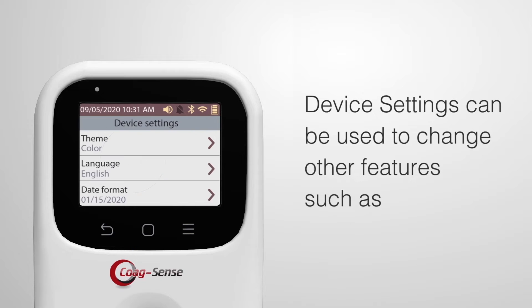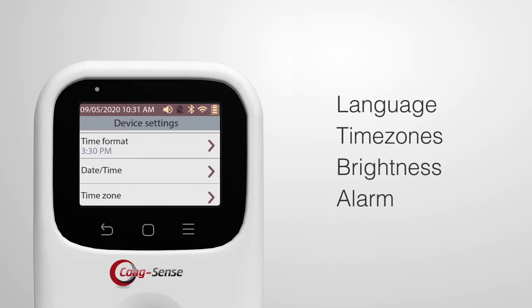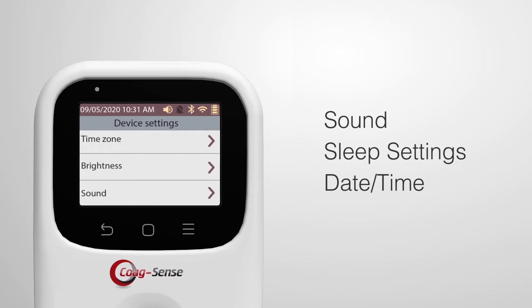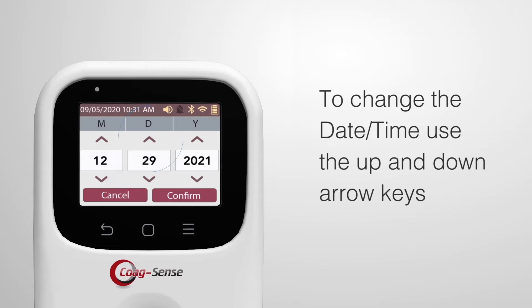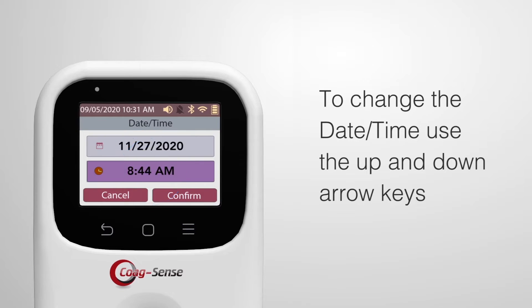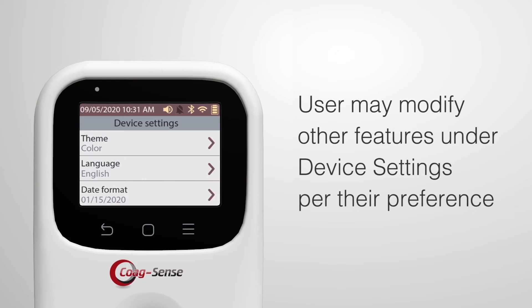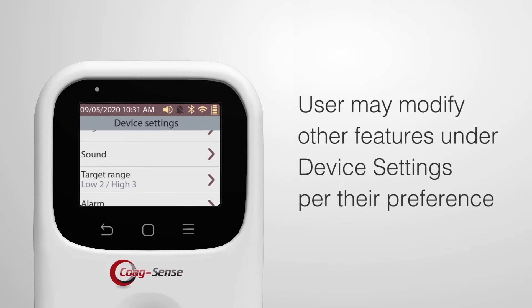Device settings can be used to change other features such as language, time zones, brightness, alarm, sound, sleep settings, and date and time. To change the date or time, use the up and down arrow keys to set the appropriate month, day, year, or hour, minutes, a.m./p.m., then confirm. Users may modify other features under device settings per their preference.